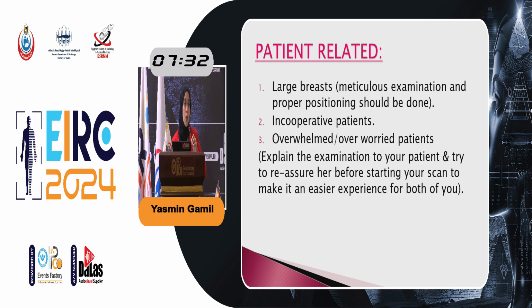Patient-related factors include large breasts. Therefore, meticulous examination and proper positioning should be done. In uncooperative patients or patients on wheelchair, overwhelmed or over-worried patients, you should explain the examination to your patient and try to reassure her before starting your scan to make it an easier experience for both of you.